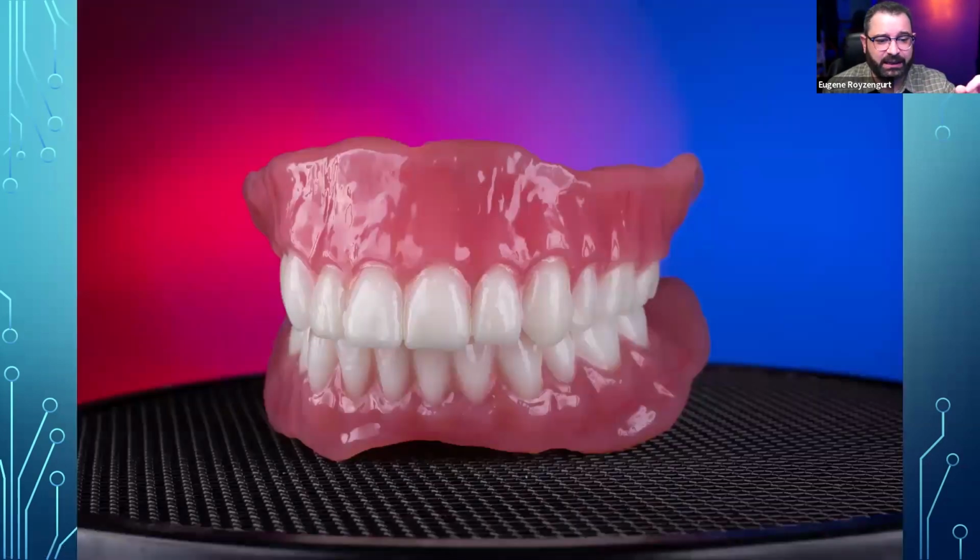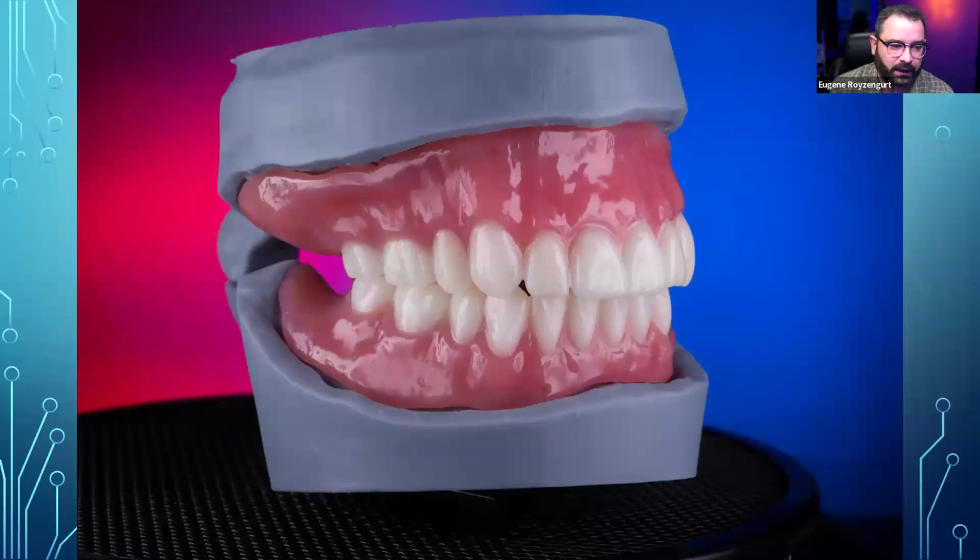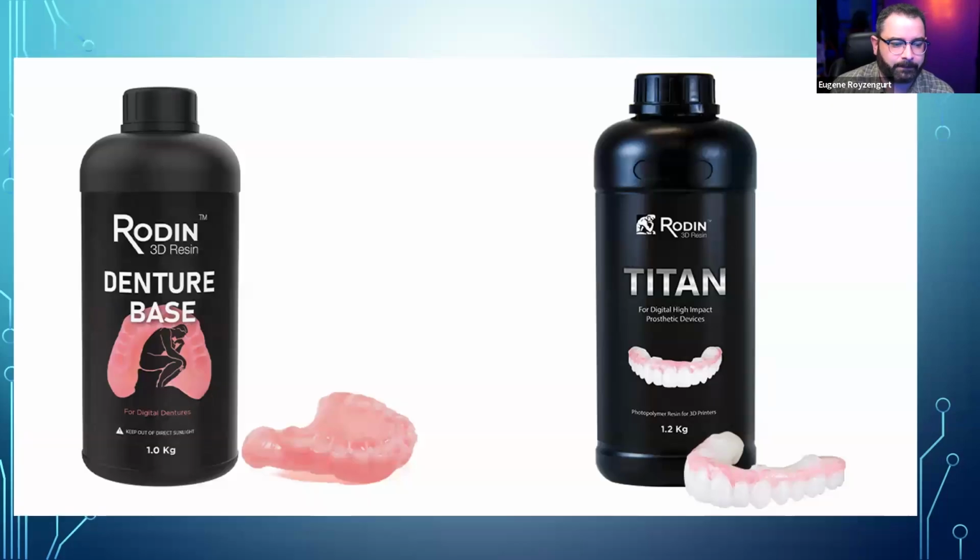And here, just adding a little bit of color, maybe a little bit of composite, or maybe a little bit of denture base. And it actually looks pretty decent, a lot better than that previous analog version that I showed you guys. So a little bit of work and you can make these things really pretty, okay? And I use my models just to verify, make sure my occlusion was good and there were no issues, okay?